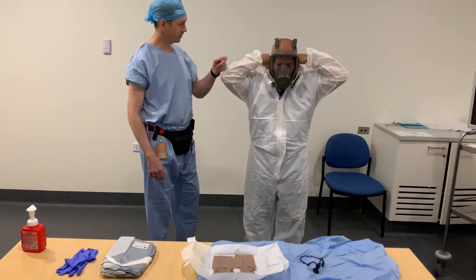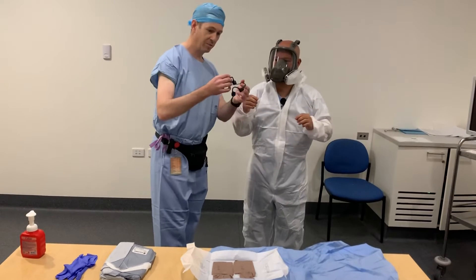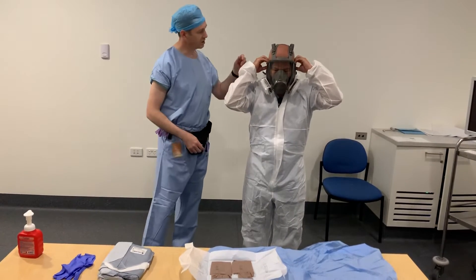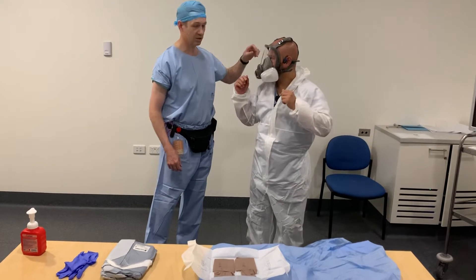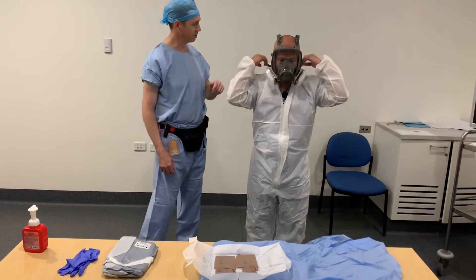Next, we're going to put the Bluetooth bone-conducting headset over the ears, ensuring that the transceivers are over the zygomatic arch, because this doesn't transmit sound — it transmits vibration. Now put the hood over that.